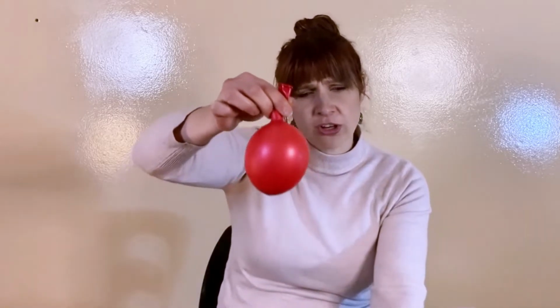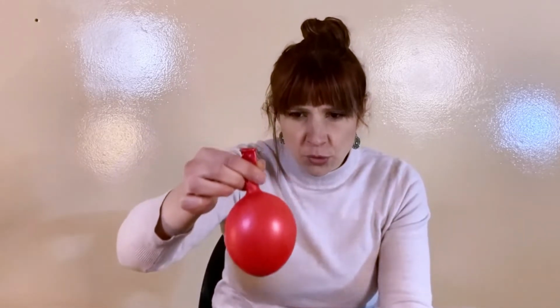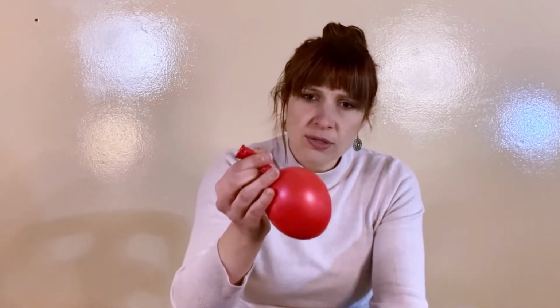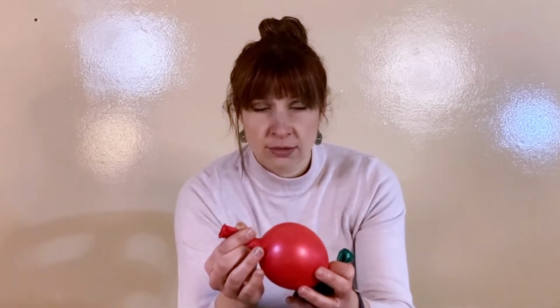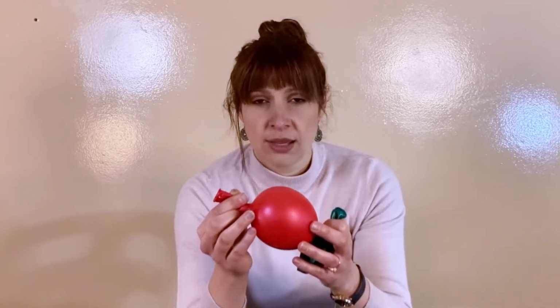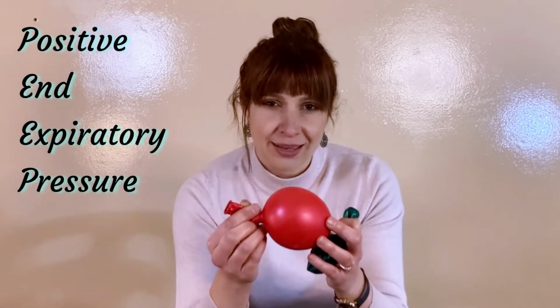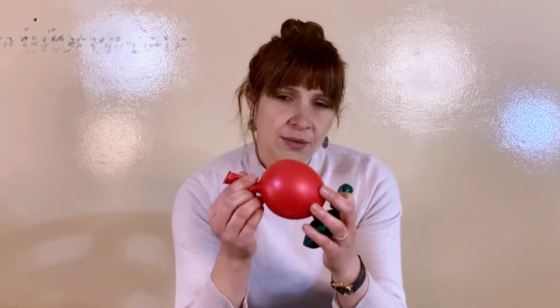So I went down to there and we decided we're going to keep a positive pressure, right? Because there is pressure inside this balloon. We're going to keep a positive pressure at the end of our out breath of exhalation. And that is PEEP. Positive end expiratory pressure.